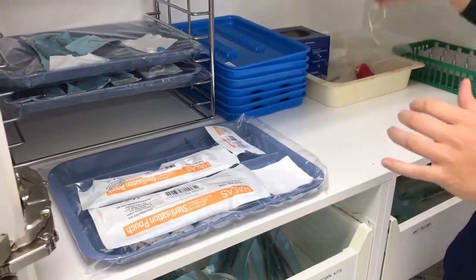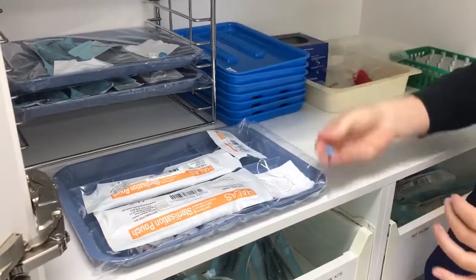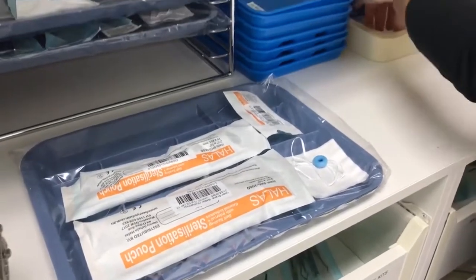And about 30cm of floss, a blue ultrasonic cover, and a dappence dish for your polishing paste.